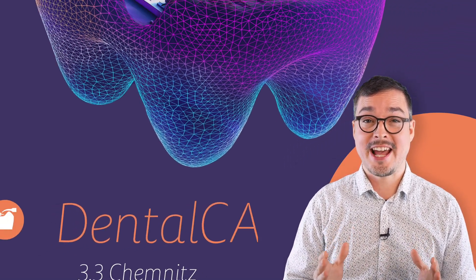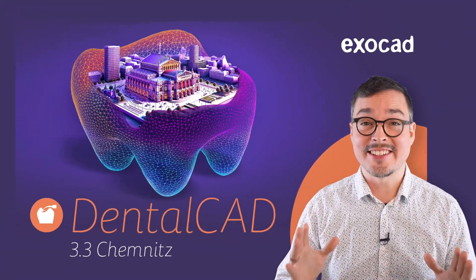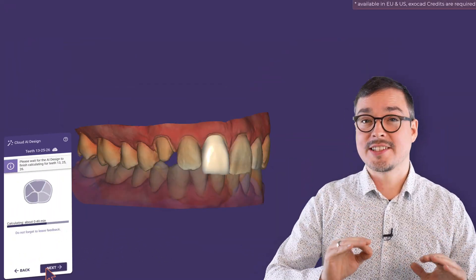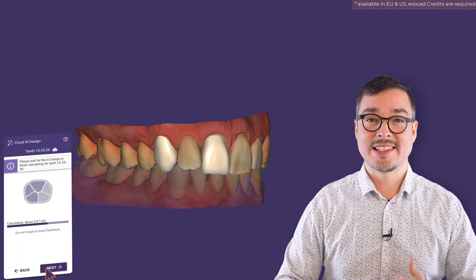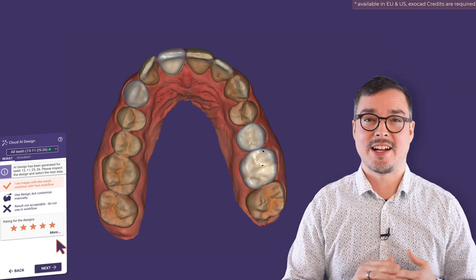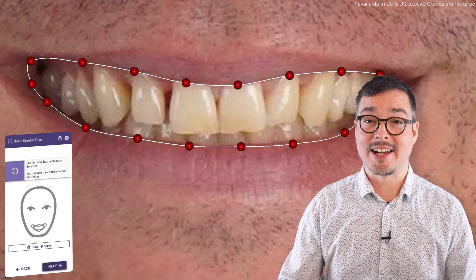Hi ExelCAD friends! With DentalCAD 3.3 Chemnitz we've launched the most intelligent DentalCAD yet. It provides access to advanced AI services such as AI-enabled multi-unit designs, realistic true smile photos and true smile videos, and more automation in smile design.